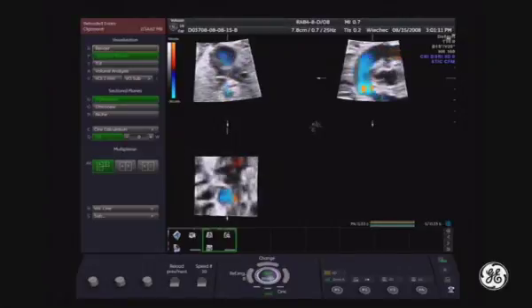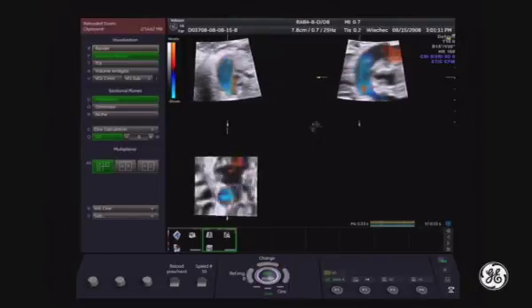At this point, you start seeing the pulmonary valve and the branching of the pulmonary artery. It looks very broad. At the higher level, which is three-vessel and trachea view, you start seeing the retrograde filling to this vessel, which in this case is the transverse section through the aortic arch. So this is the very typical view for hypoplastic left heart syndrome.